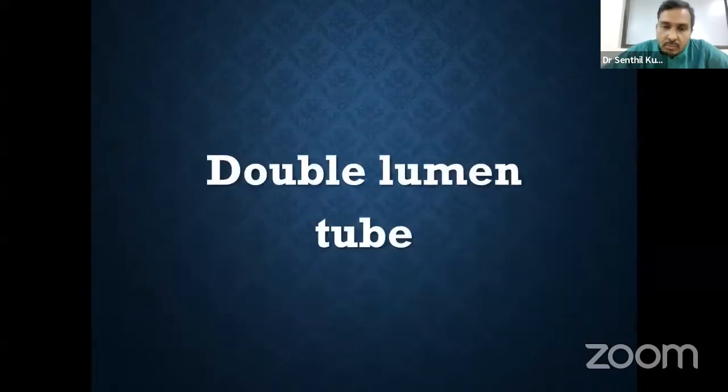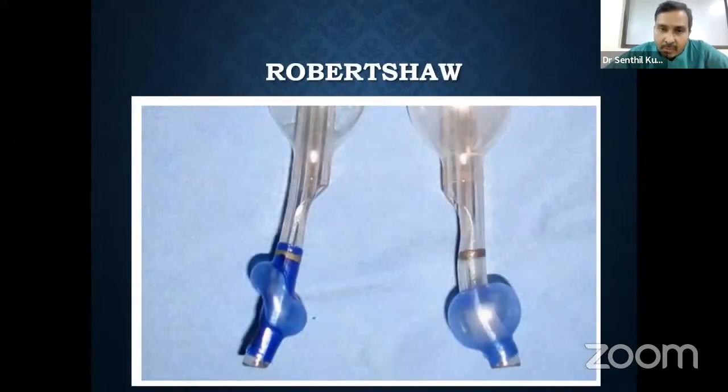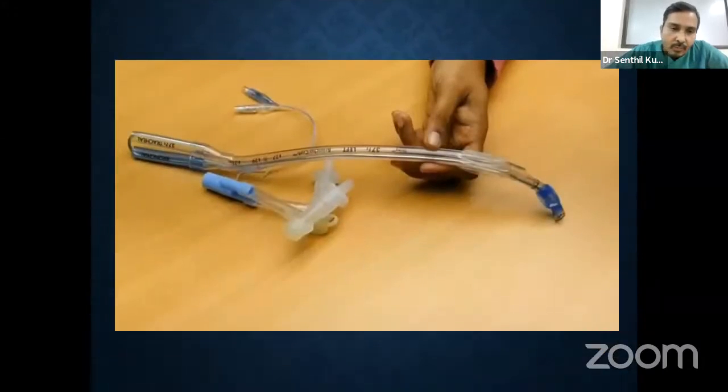So coming to the double lumen tube. This is not mandatory to know, but I'm going to enumerate a few points about the Robertshaw type of double lumen tube. This is the commonly available tube. It is available in two different forms, that is right and left side. So now let us see.